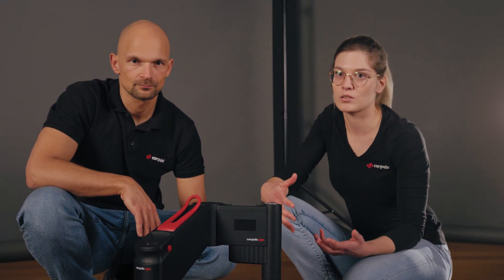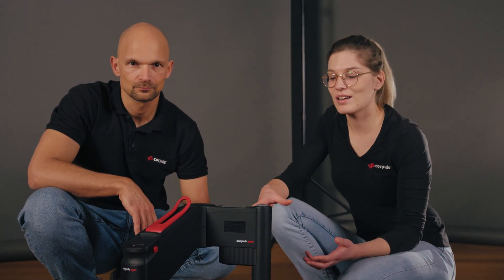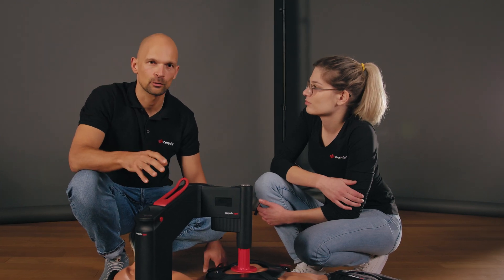In today's video we want to cover a situation that everyone is aware of: what to do when alarms appear during a resuscitation. Today we cover specifically the corpuls cpr alarms.